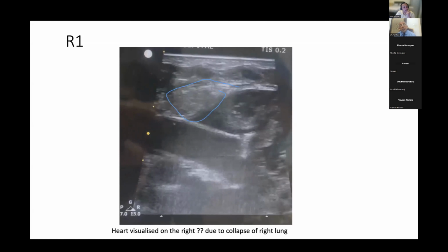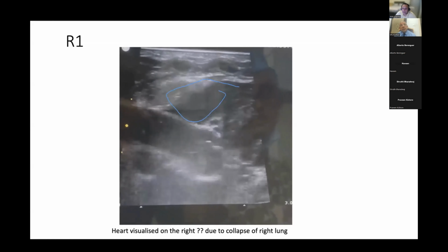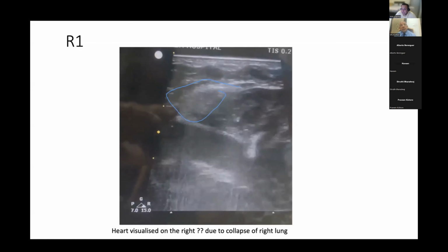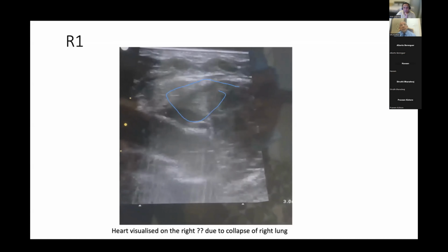The heart more to the right, with a hyperdynamic heartbeat. Okay, so sometimes in babies on inotropes you get a lot of transmitted impulse, but this is massive. You can see a large amount of the heart on that right side. So any other differentials?